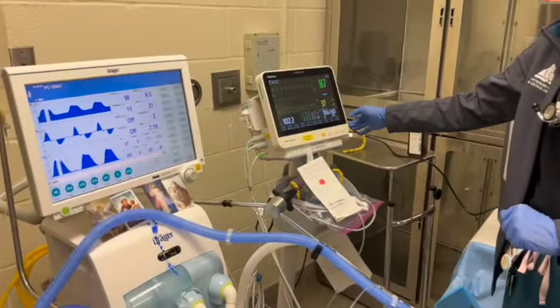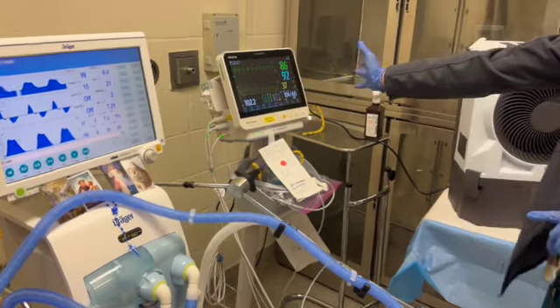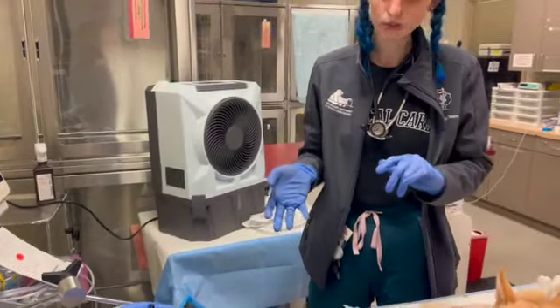And it's just zeroing out. We have our end-tidal lines here, and this is going to measure the end-tidal CO2 that our patient is breathing out, and we want to ensure that it is within the 35 to 45 range.